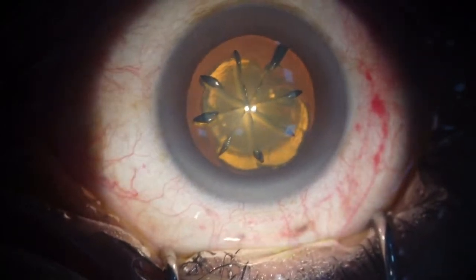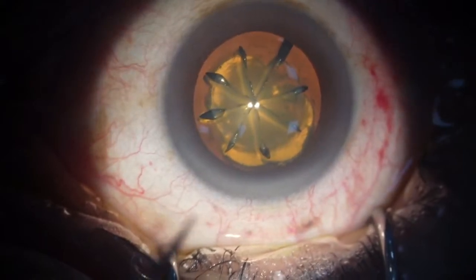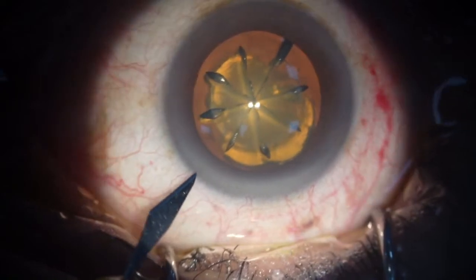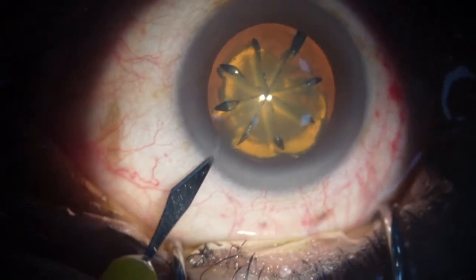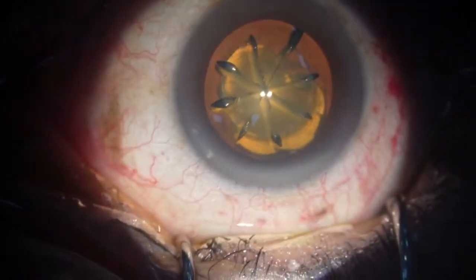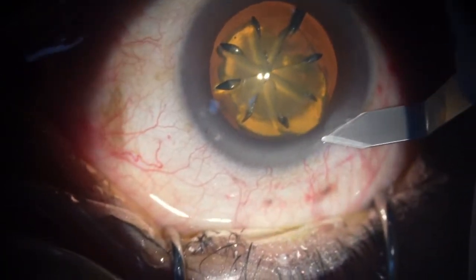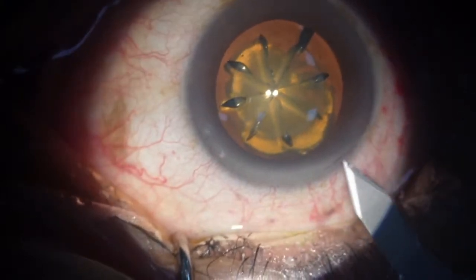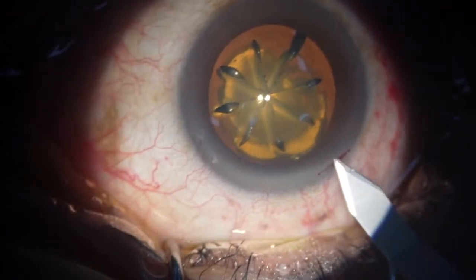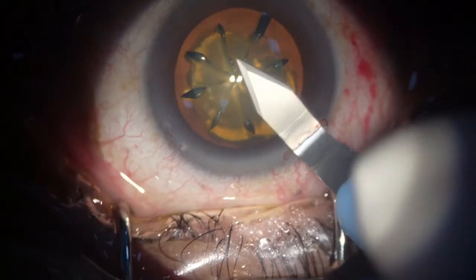Now the patient's astigmatism is at 136. The steeper axis is there, though it does not require any LRIs or arcuate incisions. So I'll just make one side port here, and that did go and touch, but that's already the capsulotomy, and I will make my main wound at 136 here. I could not do the incision on the table because I had to use the 12 millimeter LOI. So that's my main wound.